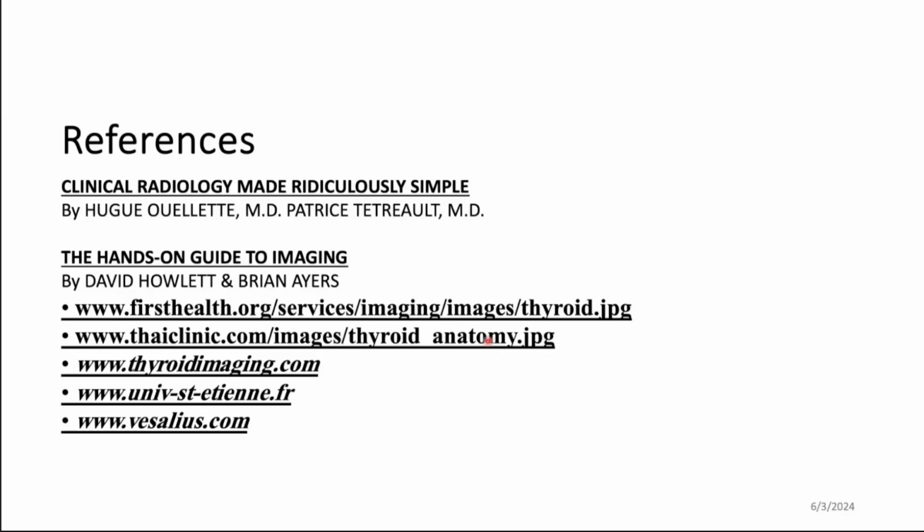It depends on the history of the patient, if this is a new diagnosis or not, if this is a follow-up or not, if this is a treatment of metastatic disease. So it depends on the history. They will choose a different radioisotope agent. Does it answer your question? Okay, thank you, doctor. All right.